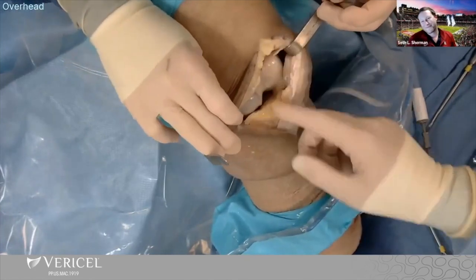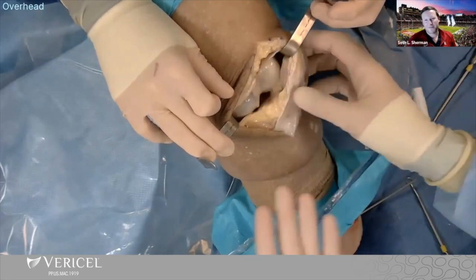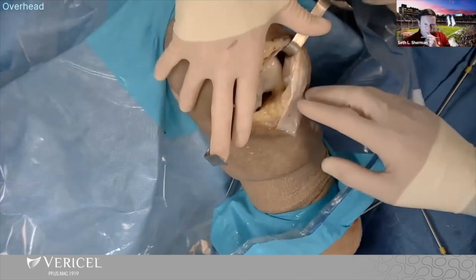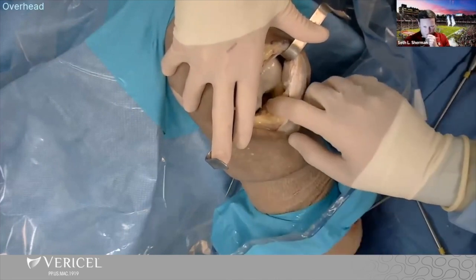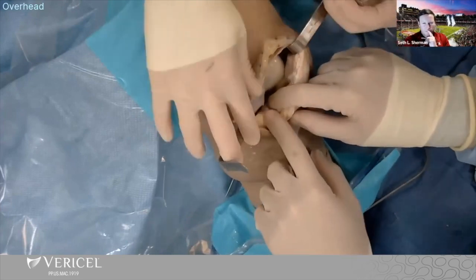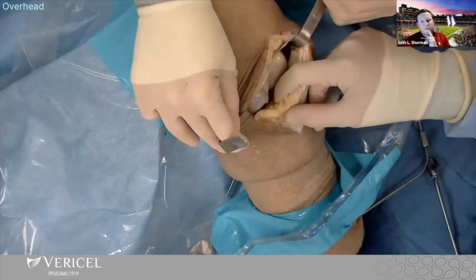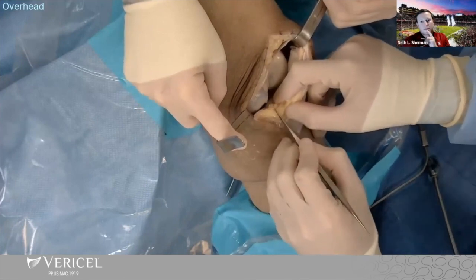I extended here — some people do a vastus-sparing approach, but for a big patellar defect or trying to get a lot of access, we're lucky this cadaver is much more flexible. With live tissues, sometimes you have to make a bigger extension even to get this type of access. With the fat pad, I'm trying to take less and less of it out because I worry it's going to cause arthrofibrosis or stiffness, but I will do a little fat pad release. The key is when I'm making my incision, you want to make sure you don't damage the meniscus — that is the number one thing you worry about with this approach.